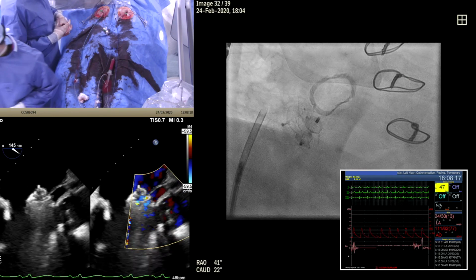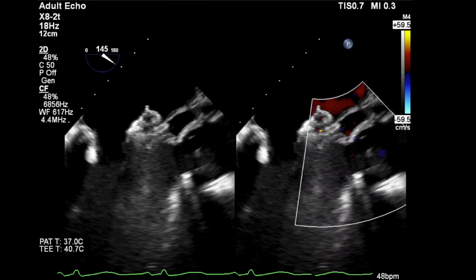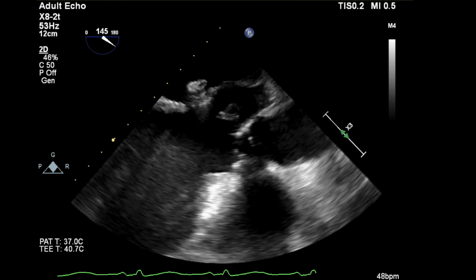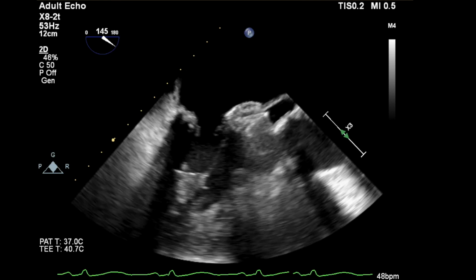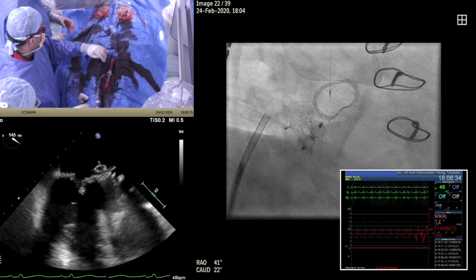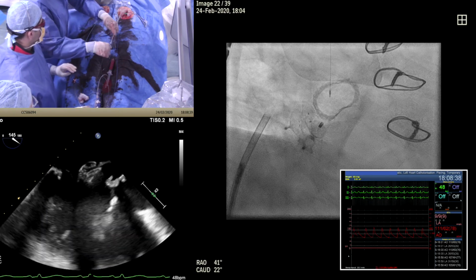Yeah. So okay, good. So it's safety checks from Bushra, and what we're going to do is we're going to close up, and the closing up part of it will be, we might as well do it in stages. Let's get the venous situation sorted out first. Can we have some protamine, please? Okay, so that's for the aortic. That's for the aortic. So you got the wire.